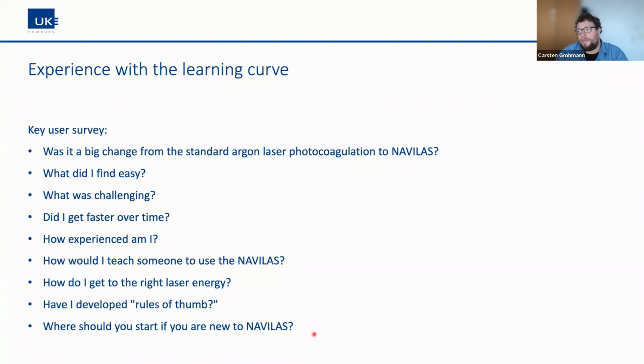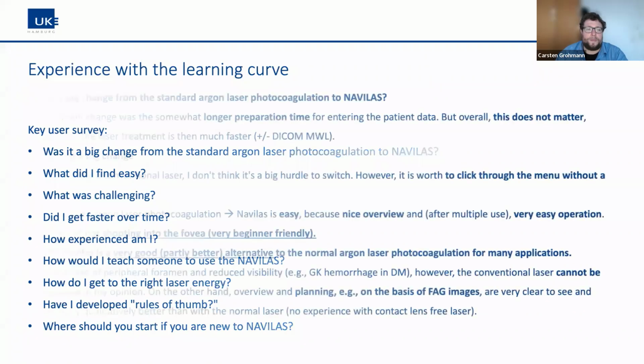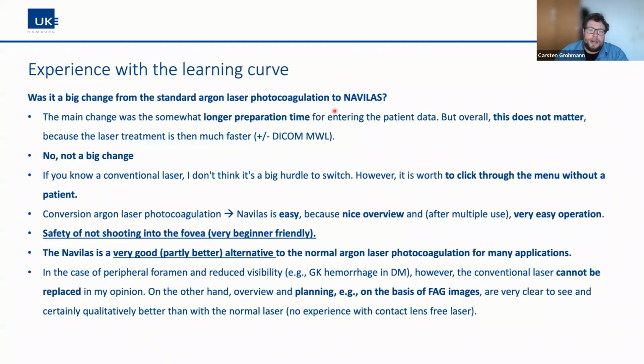So I made some choices for this presentation. Was it a big change from the standard argon laser to the Navilas? A longer preparation time for entering the patient data. Yes, it's true. You have to prepare the patient on the laser. You have to enter the data, but in some hospitals that have a PACS, a picture archiving system, you can use the DICOM modality worklist, so the patient data is transferred automatically to the laser, and the laser protocol is also transferred automatically back to your system after the treatment. No, not a big change.